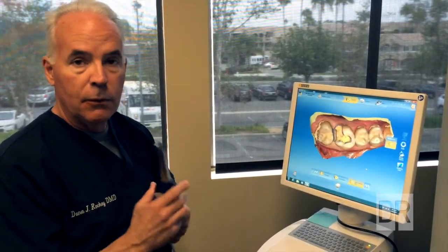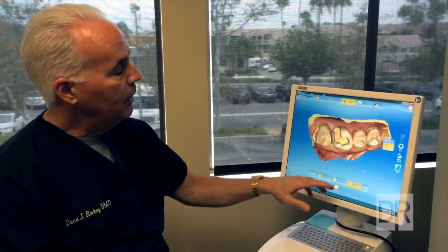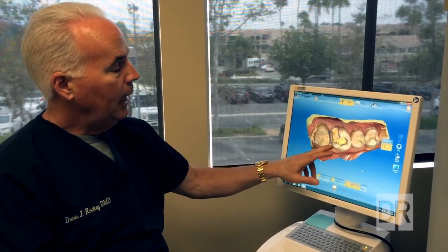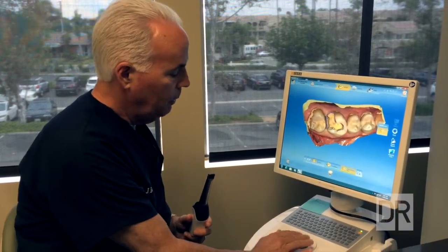Then using this camera — a digital camera that goes over the tooth — it produces these pictures here. With software inside the machine, we can manipulate it such that we can actually make a projected model of the tooth and a solution to this, which we can show you right here.